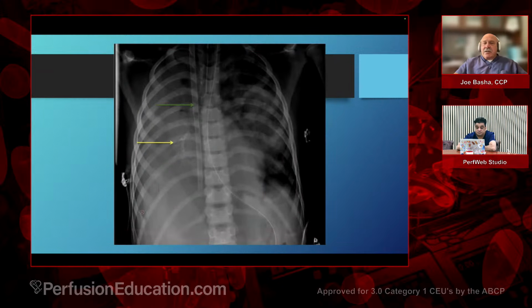Here's a standard X-ray showing the Avalon cannula's position. This is looking at one of the drainage ports. There are drainage ports down here, and this is pointing towards where the exit would be. It's not necessarily the best diagram with the best arrows, but that's basically what you expect an X-ray to show.